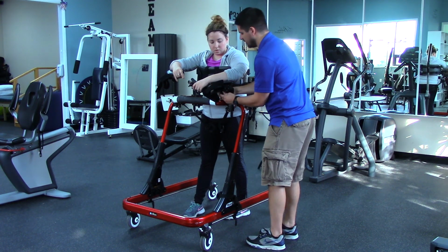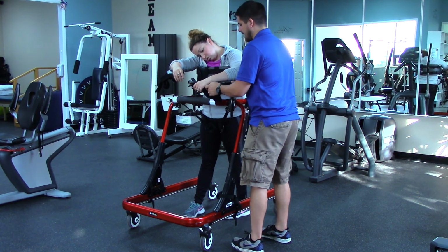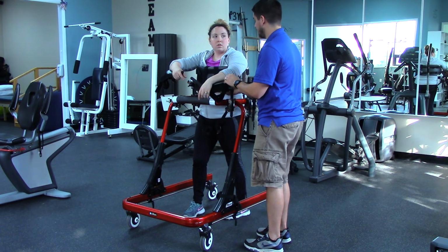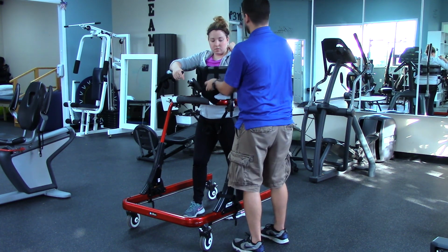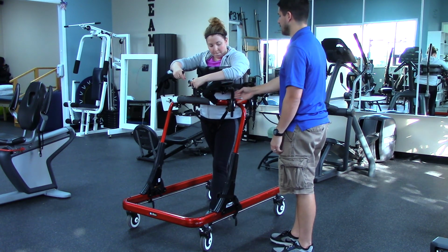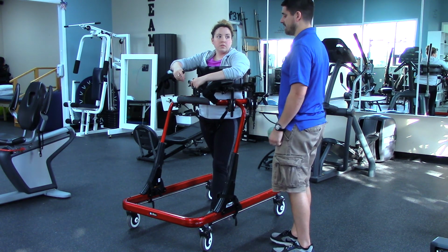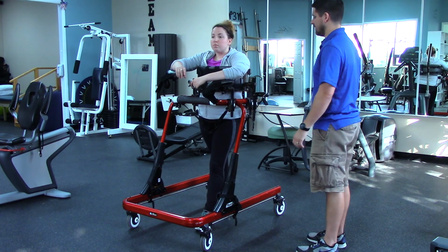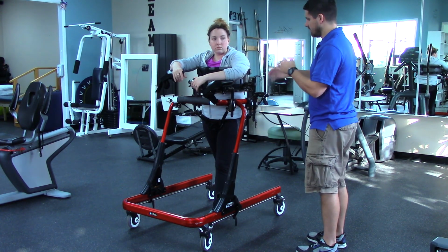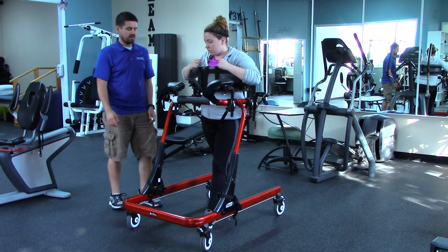Okay. From here we can also adjust the arm prompts. Down here is going to loosen and let them come in or out, depending on what we need. Like my main man today, dependent, he's going to be more in this position because he's going to be trying to pull in the whole time. I don't even use these for some people for that reason. If he's going to be fighting it the whole time, then I'd much rather he just have his arms free doing whatever he wants. But if they're going to be offered for support, there's definitely that adjustability to get them into it as they need.